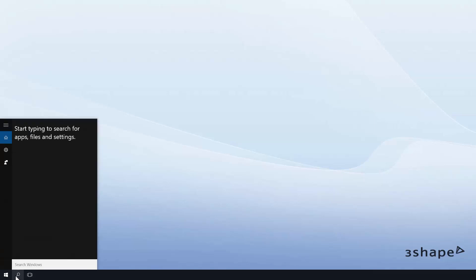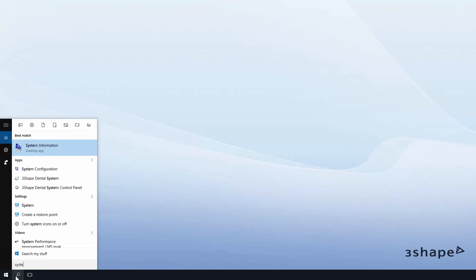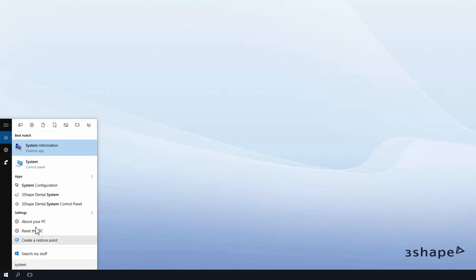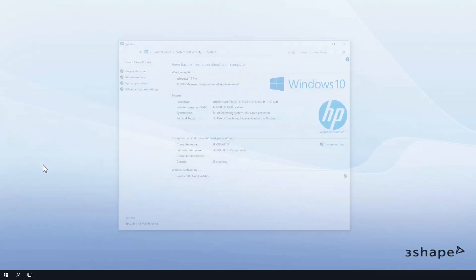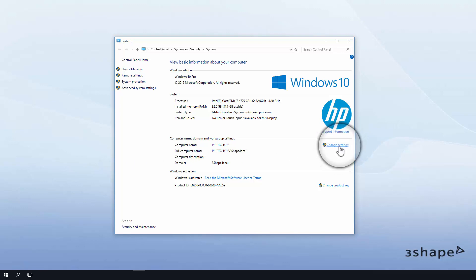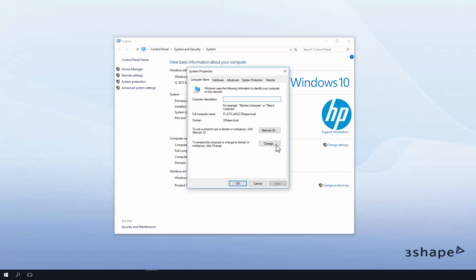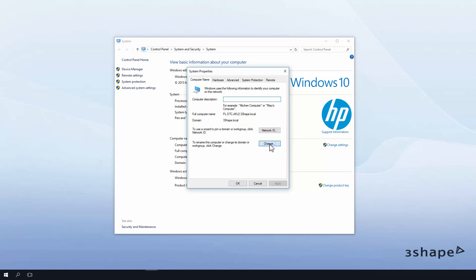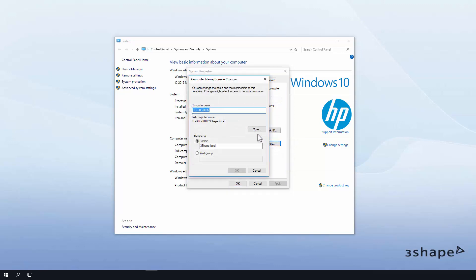Then go to System, Change Settings, and click on Change to set a unique name for the server on the network.